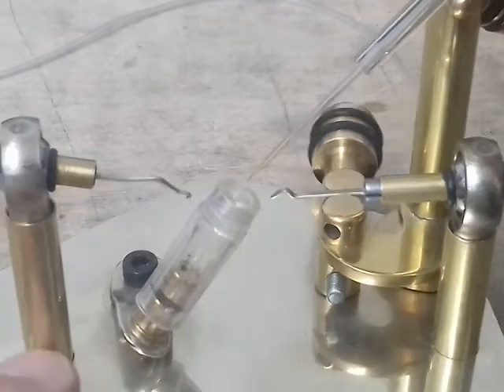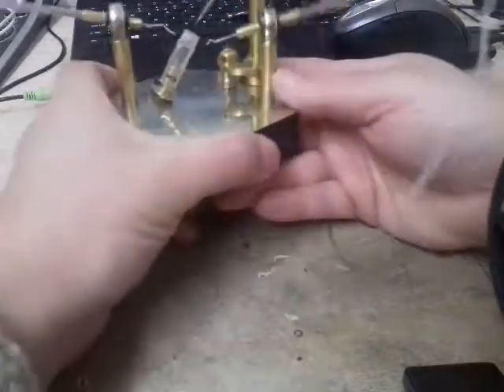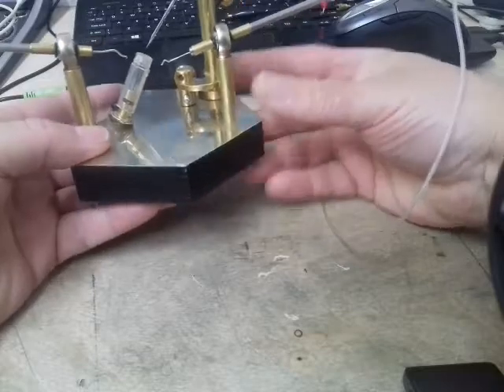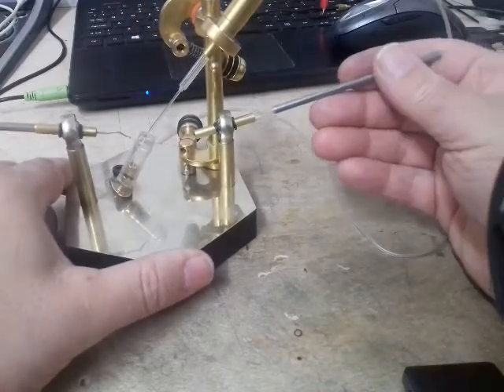It turned out that way. So that's the unit there, which I'll be using probably all the time. It's only a tiny thing; it almost fits in your pocket. If you took the levers out and the needle out, it wouldn't fit into an outdoor coat pocket.